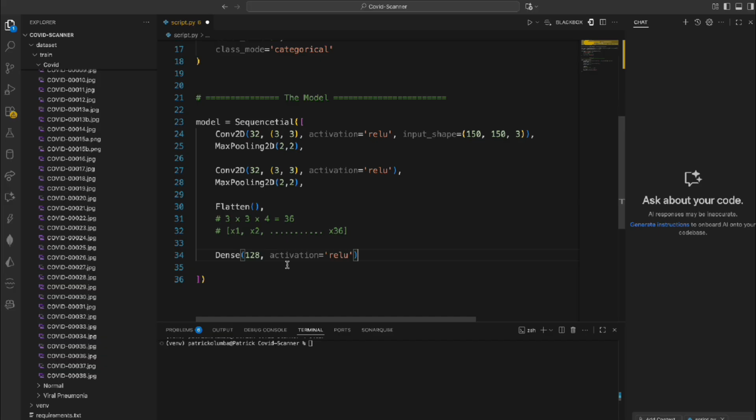It becomes good, almost like human beings, at knowing exactly which one is which when it comes to classifying a healthy person from a person who has COVID or pneumonia, right? So that is that on that one.